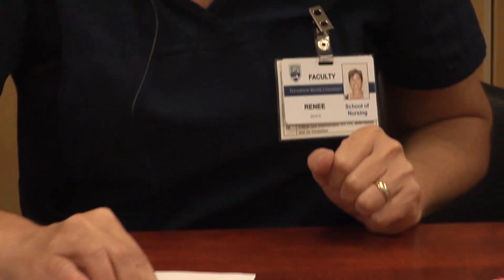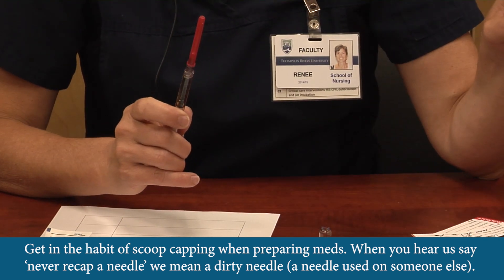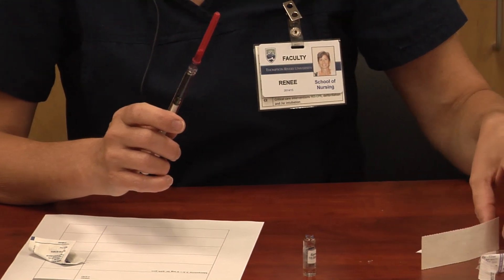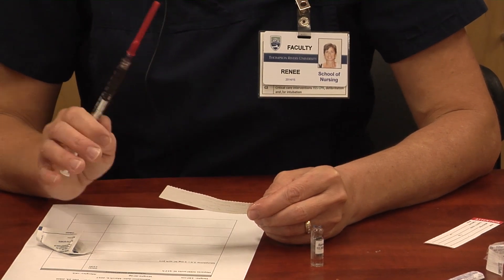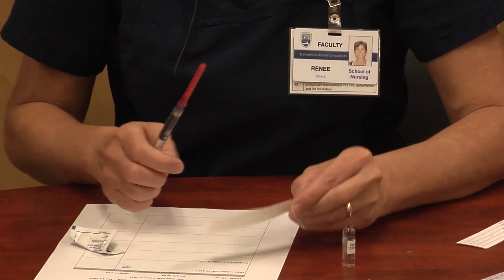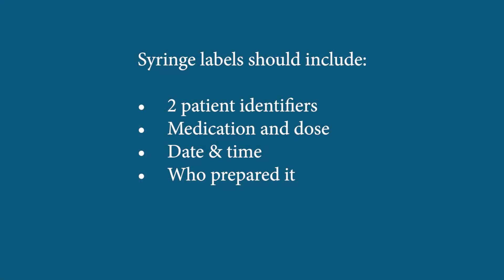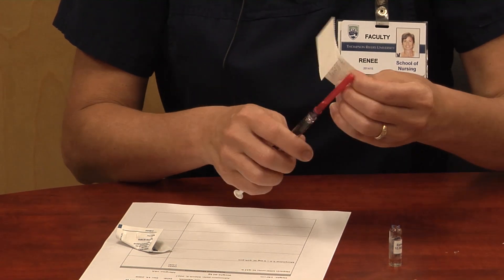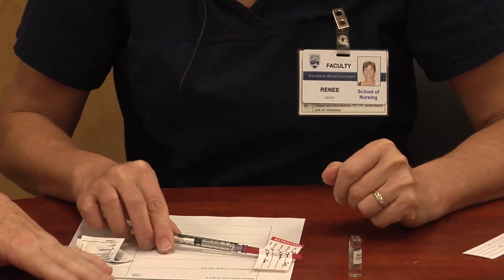I'll recap the needle using the scoop cap method, then change to the needle I'm going to inject into the patient. Before that, I need to label my syringe before going to the bedside. The label should include two patient identifiers — name and birth date, or name and hospital number — plus your drug, dose, time, and your signature, so you know at the bedside this is definitely the medication you prepared.